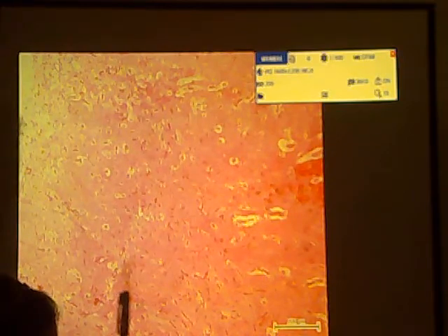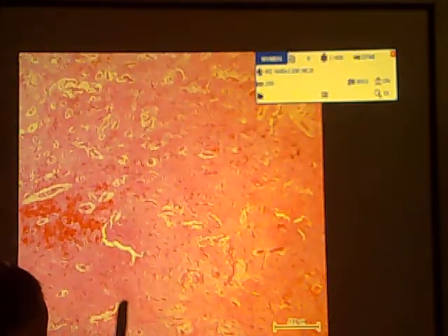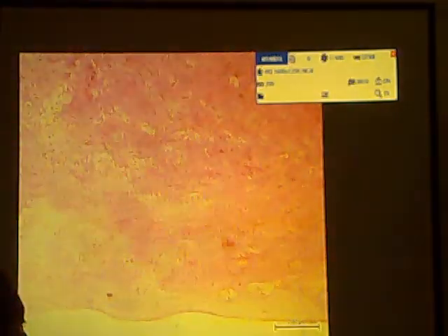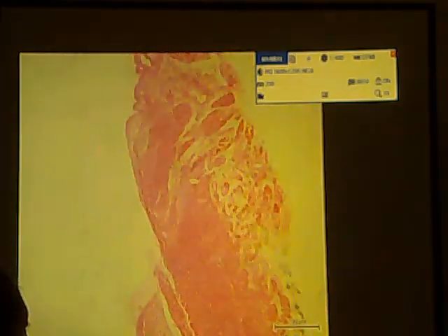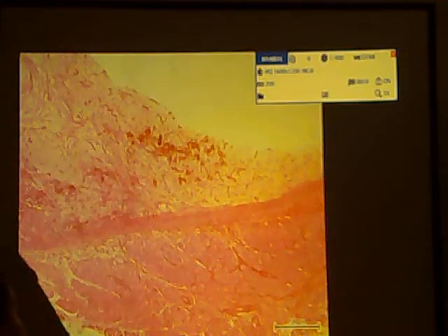So, what are the typical histologic features of cardiac myxoma? What do you see? What type of cells? Describe the stroma. So this is the mass starting from here up to there, and your normal tissue, the heart muscles, is here. As you can see, it is different.